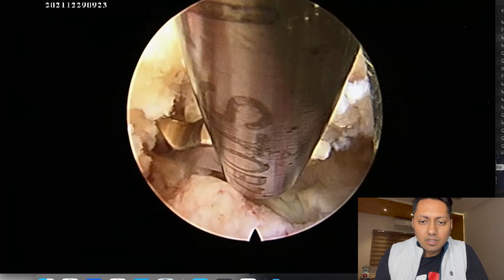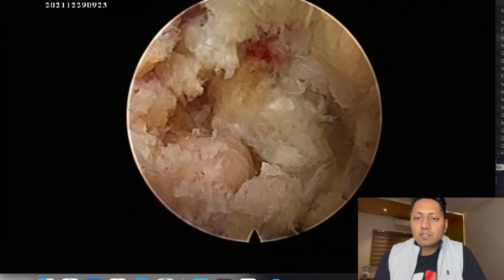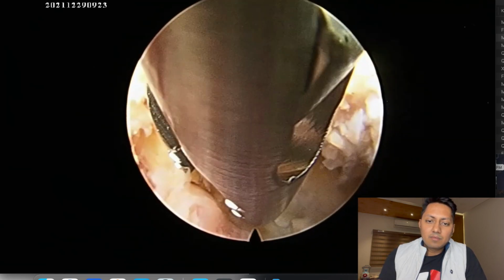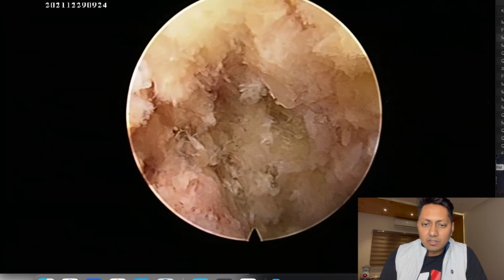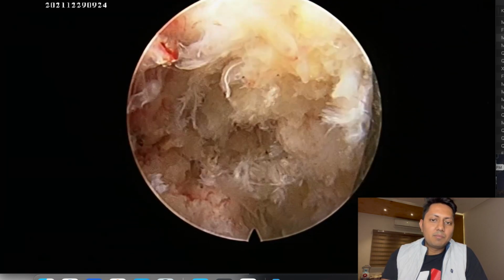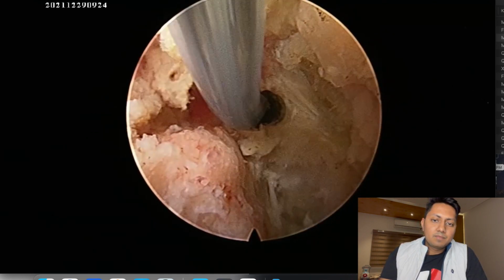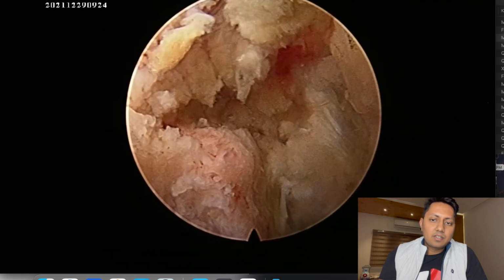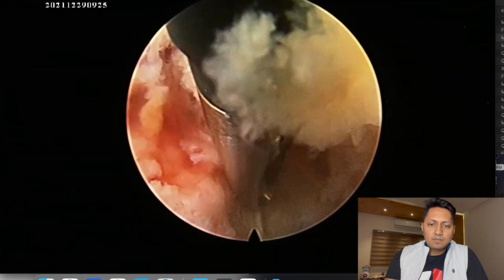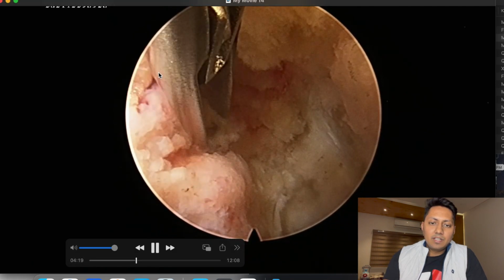Now this is the same articulated curette that I am using to detach the upper end plate from the annulus. Now this is a tooth grasper that will just break up the redundant part of annulus and the nuclear material, and we have almost done our decompression till the midline over here, but we'll remove some more disc material. As we coagulate, these structures shrink and we can visualize it much better. I hope you can appreciate that this is the dura which is lying freely.